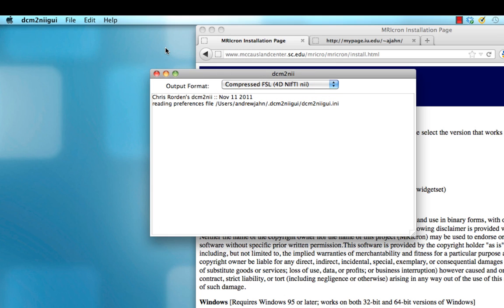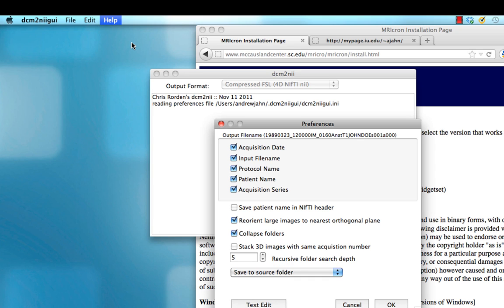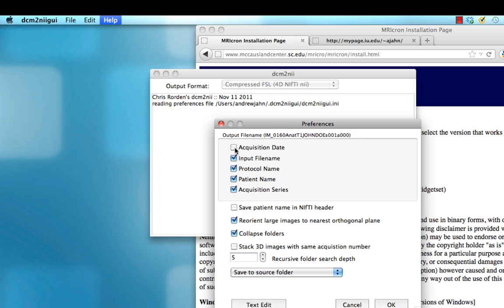One more thing you might want to check is under the help and preferences options, you're able to specify what information you want prepended to your NIFTI files. Most of these you don't need, and you see an example of the output file right here. This looks rather long and unwieldy. Go ahead and uncheck everything except for acquisition series. This makes the resulting output files much easier to read.